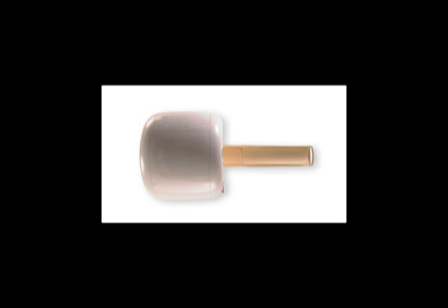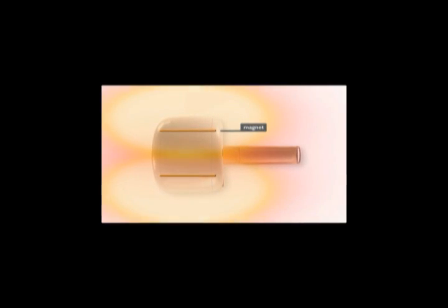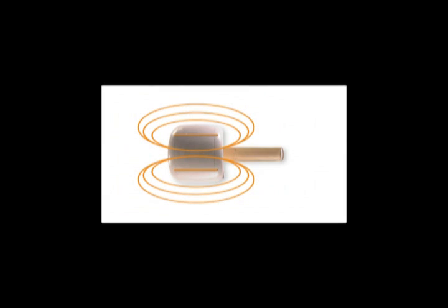The main magnetic field generated by the magnet is not completely contained within the bore of the magnet. In fact, the magnetic field goes right to the edge of the room. All magnets are surrounded by a magnetic field, represented by the magnetic field lines.